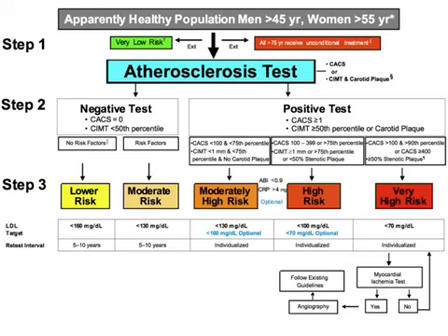They can put it into a risk stratification pathway like this, or algorithm, and they can decide if they're going to put them on a certain type of anti-lipid agent and a certain type of antihypertensive, and watch these people over time. Now, historically, it's been difficult to get serial CIMT measurements because it's hard to do logistically. They get lost to follow-up, they don't keep their appointments. You've got to get these people in to see a sonographer on a regular basis. Sonographers are expensive. It's just logistically hard to do.